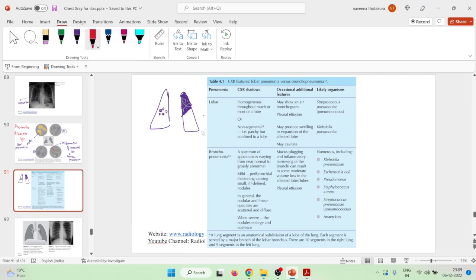Pleural effusion can also be seen in lobar pneumonia. It may produce swelling or expansion of the affected lobe. Sometimes cavities may also be seen. Lobar pneumonia most commonly occurs due to organisms like Streptococcus pneumoniae and Klebsiella pneumoniae.